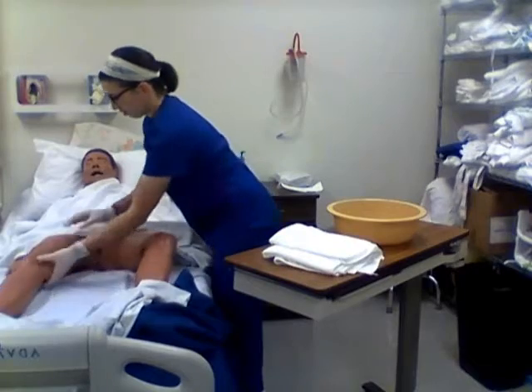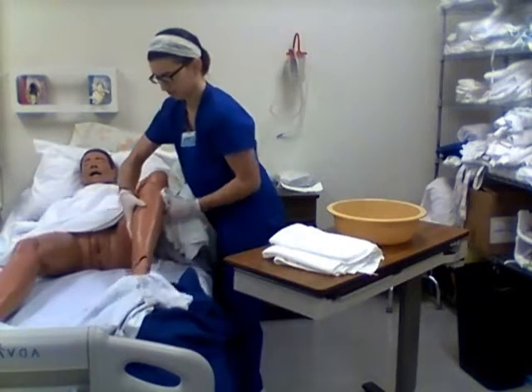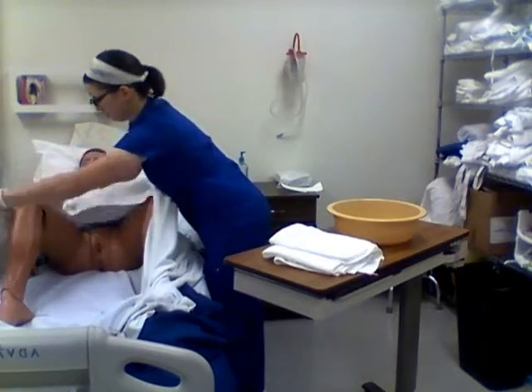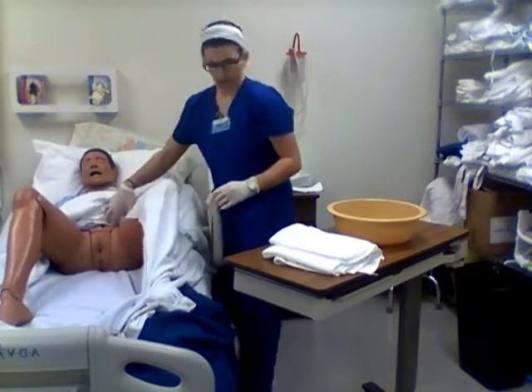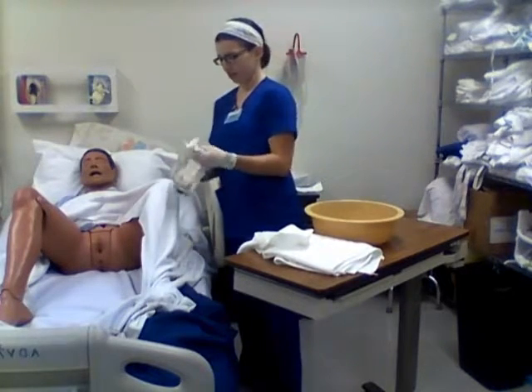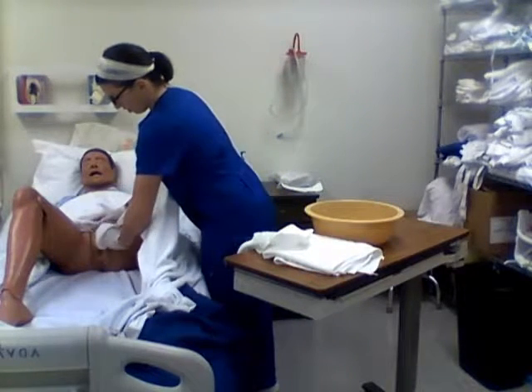All right, so to make sure that she's comfortable the way she wants to be. All right, you can see that good there. All right, so now I can go ahead. First, I'm going to start washing her. And so we're going to have our water. Make sure that she's nice and washed.